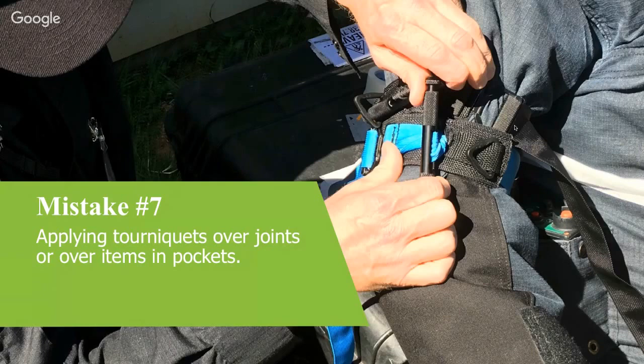That really frustrates me as an ex-military person working in the civilian setting now. It's on your protocols, so you should know how to use it. It's that old mentality that tourniquets are bad that's unfortunately still in the civilian system. We're just not learning. So push for it as best you can, mate, and stress that it's in the Resuscitation Council guidelines to use tourniquets, albeit as a secondary hemorrhage control, but you should know how to use it.